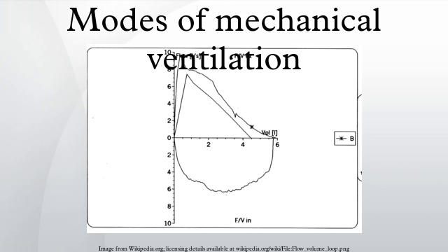Cycle. Cycling is the method for how a ventilator knows to give a breath and stop a breath. Cycling is the governing system for how a breath will ultimately be applied. Parameters vary, but rate, I:E and other similar parameters are almost always set by the clinician alongside the cycle.